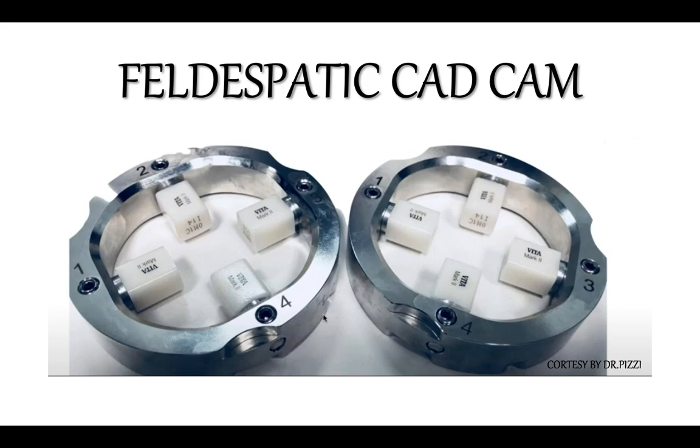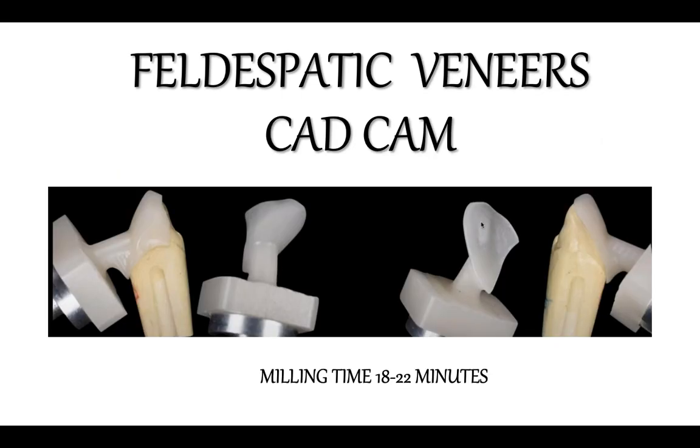But it exists, and some labs do it. And it looks nicer, of course, because as you can tell, the ceramic that has the most precious optical characteristics is the feldspathic.